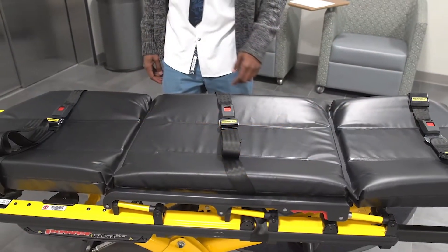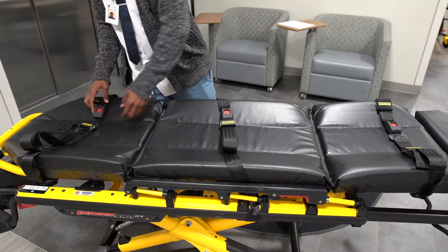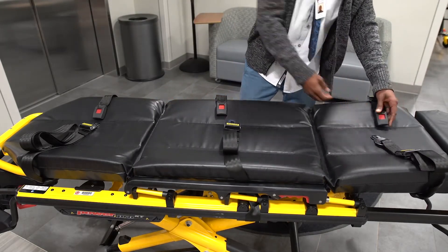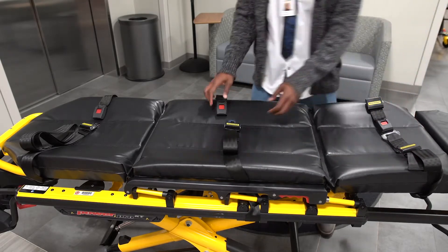This stretcher also comes with seat belts to help with movement restriction. To unfasten them, just press in the red buttons. And to fasten, slide the silver clip into the buckle until it stops.